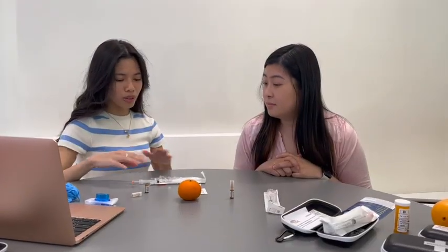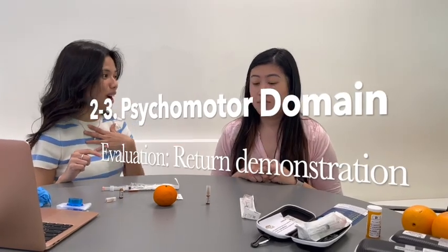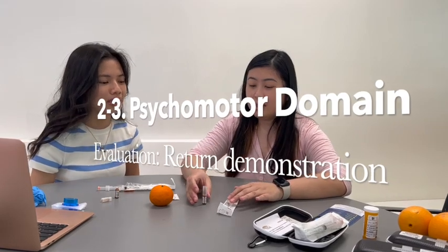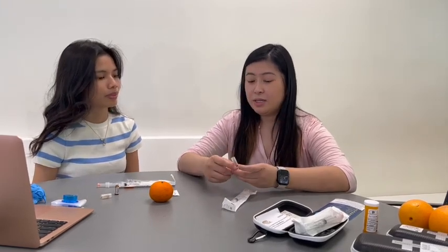So I showed you how to draw the medication out from the ampule. Are you able to demonstrate how I did that? I could walk you through it too if you need help. Yeah, so you said one ampule, and then a syringe, and also gloves, but in an emergency situation, we don't have to use them. Yes.